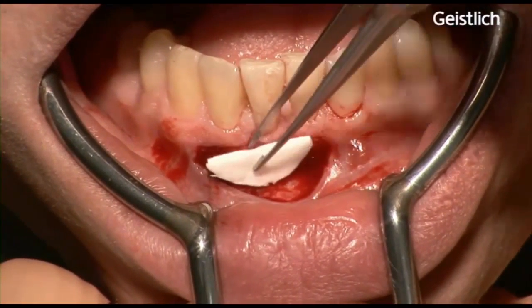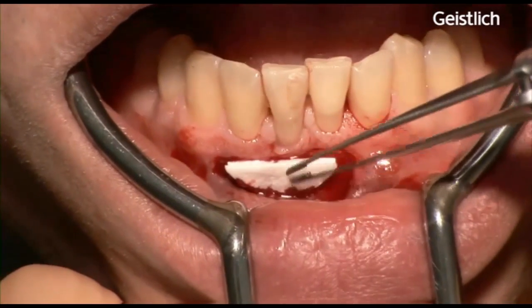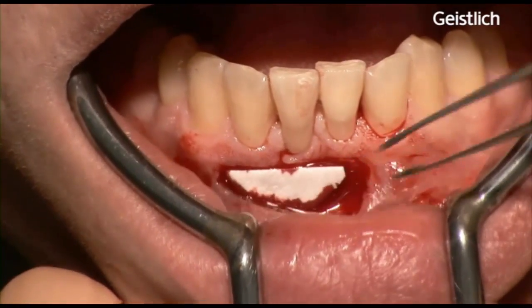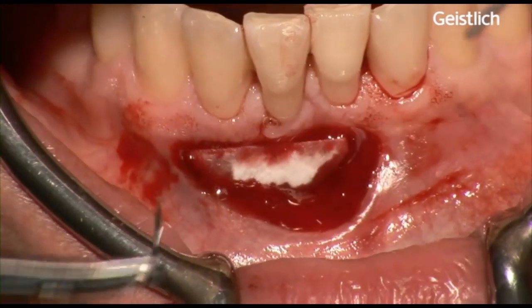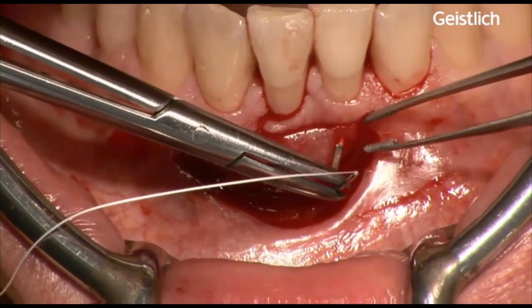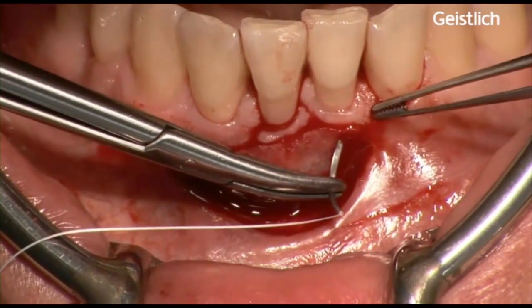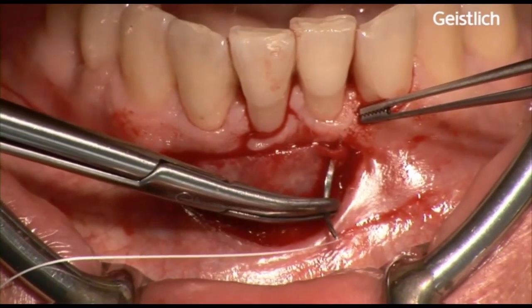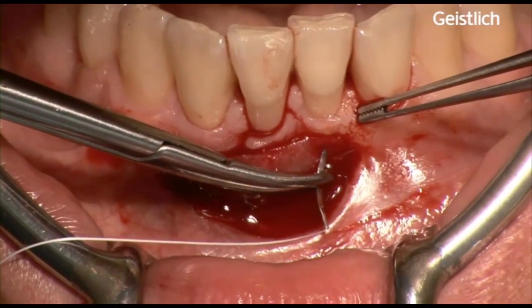Mucograft is placed on the prepared periosteal bed with a smooth surface facing the oral cavity and the porous surface facing bone and periosteum. The matrix is fixed to the small coronal band of keratinized tissue and to the periosteum and, if necessary, to the surrounding soft tissues with non-resorbable, non-irritating 6-0 interrupted sutures. Complete penetration of the matrix by blood and exudates allows perfect adhesion of the device.